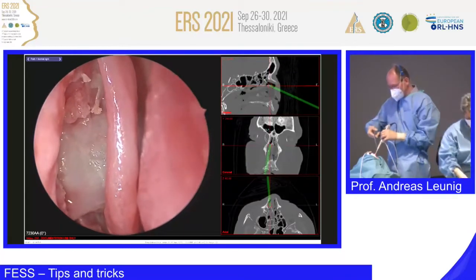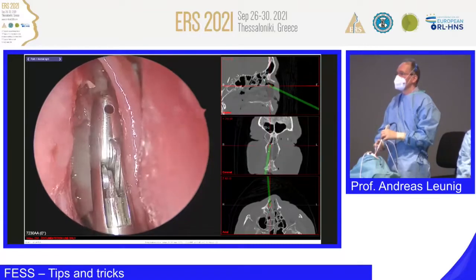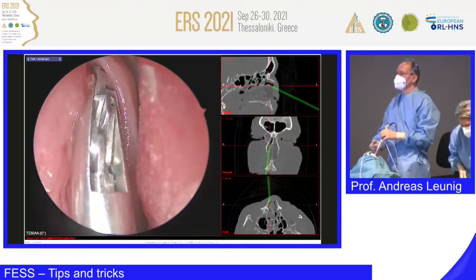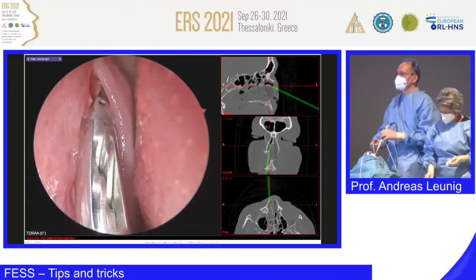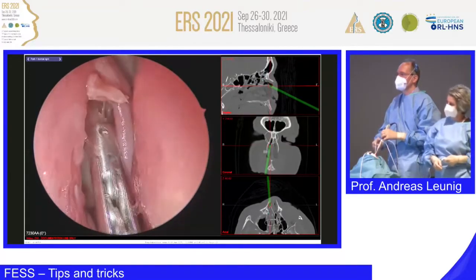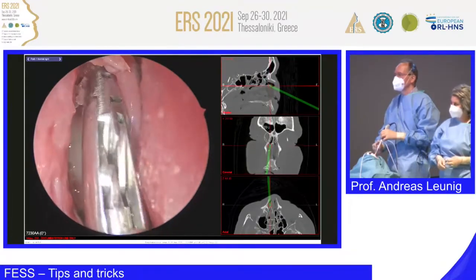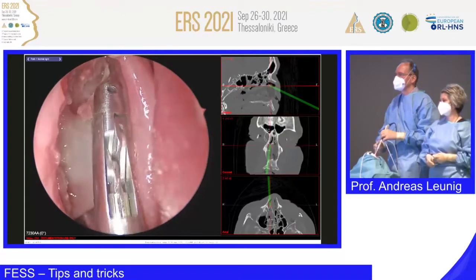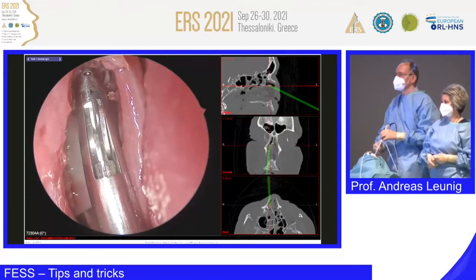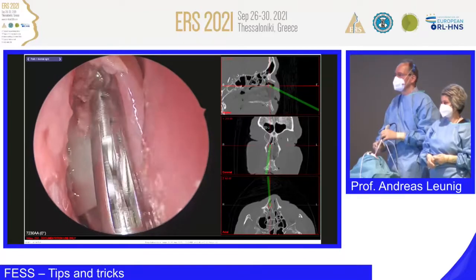I did for many years the classical approach, but then I had a surgical day where I had two or even three patients who were always perforated in the lamina papyracea, and I was not happy about this, and then I switched a little bit. But it depends a little bit on the anatomy. Sometimes the anterior approach makes sense and is easy to go, and if not, you can just do the swinging door technique. So you have to individualize your surgical approach.